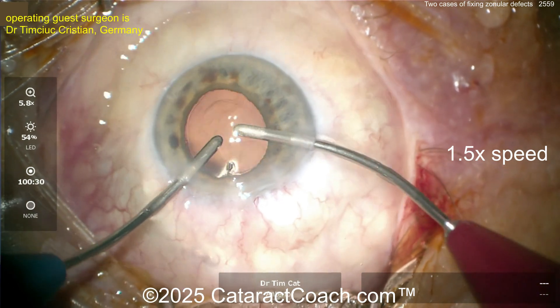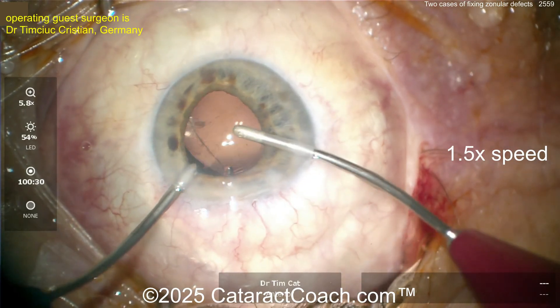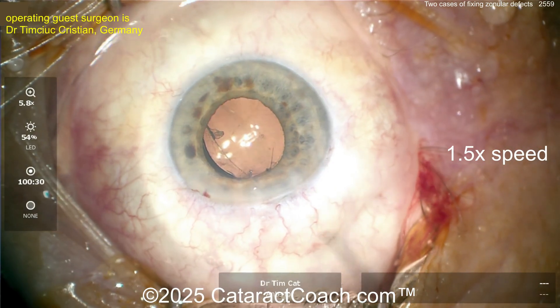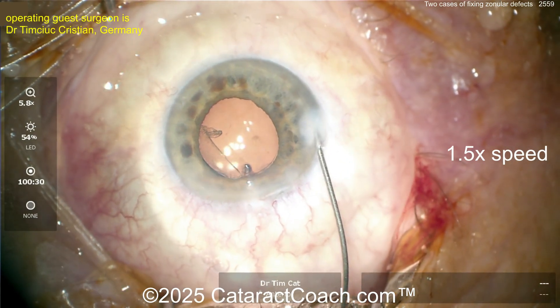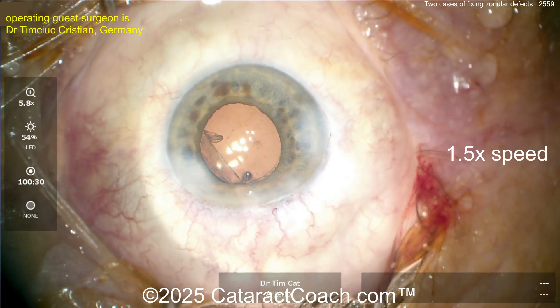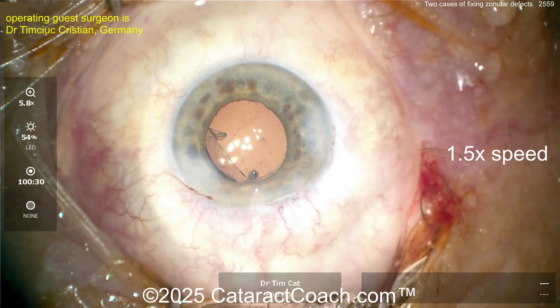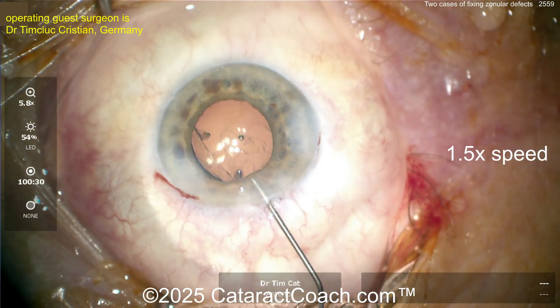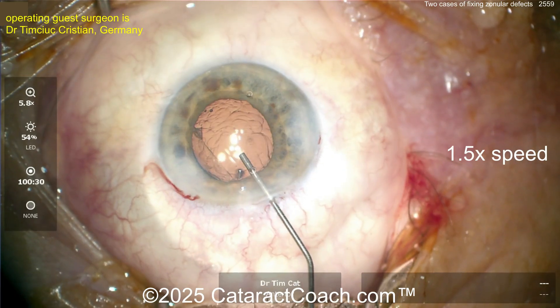The IOL is going inside the eye and you try to tilt the lens a little bit to get out all the viscoelastic — and whoa, what is that? That's the edge of the rhexis. So now you've got probably three clock hours of zonular loss, and that was just from tilting the lens against the posterior capsule because of the zonular weakness pre-existing from the pseudoexfoliation.